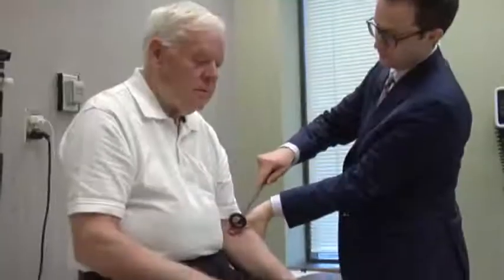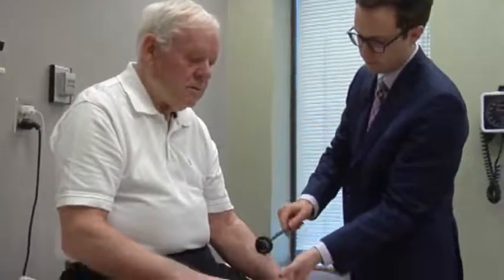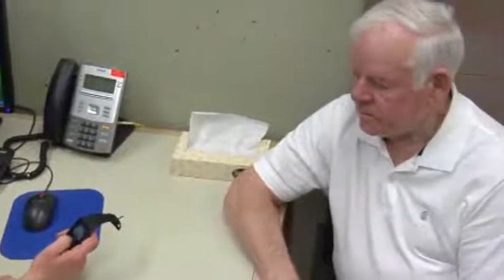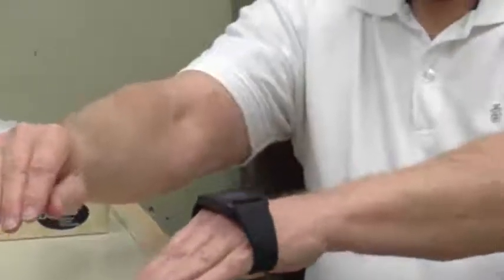When you have Parkinson's, you have a lot of doubt in your mind about whether you really have it or not. If somebody can tell you that you have Parkinson's without having to go through MRIs and other kinds of things, I see a real benefit in that kind of a relationship. The study went very well, so when we analyzed the data, the watch did a great job, so better than 90% accuracy in separating these two kinds of tremor, and so we're very happy with that.